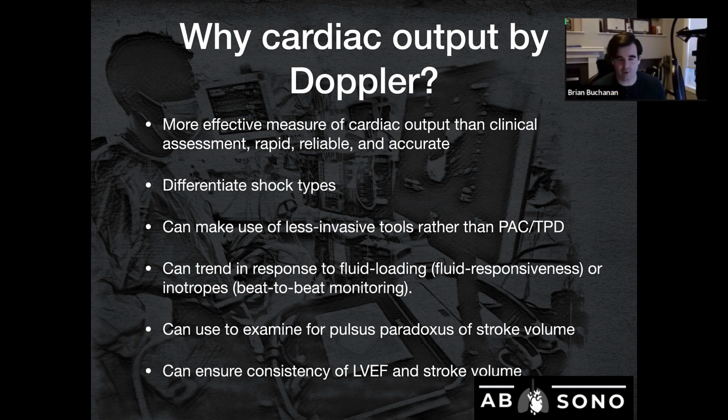Yeah, I would agree. If you acquire it well, with a nice clear angle and a good waveform, you have a really solid objective measurement of what that output is like. So one of the main benefits is that it's reliable and accurate, and if you can do it well, it is really helpful at the point of care. Of course, I use it quite often for differentiation of shock types, for example. Obviously, it's less invasive, and you can trend it really easily, much more than say an ejection fraction can. Certainly, there is more of a time input in learning the technique, but it's worth it in terms of the input versus the benefits yielded.